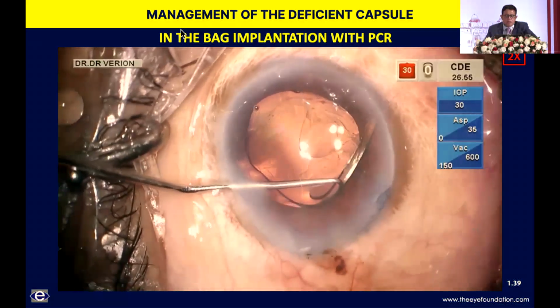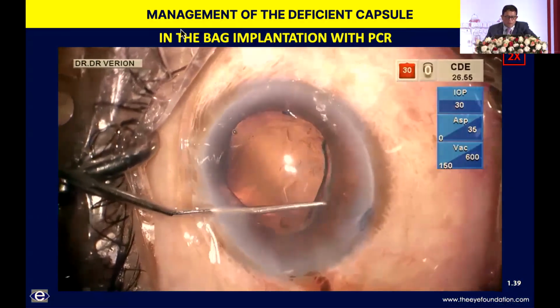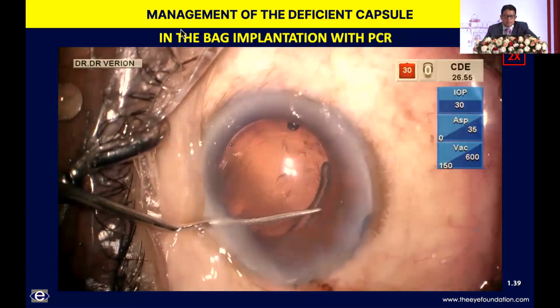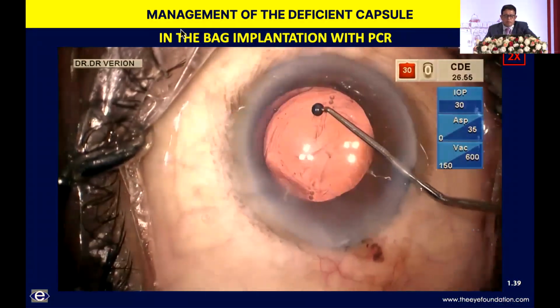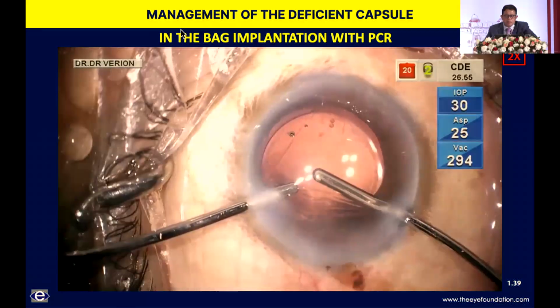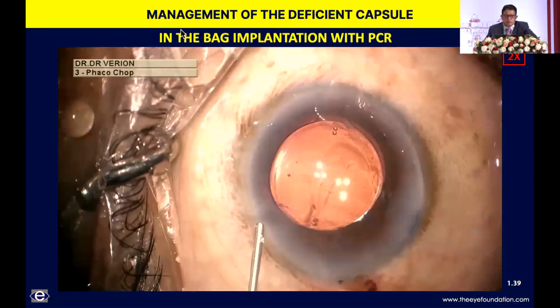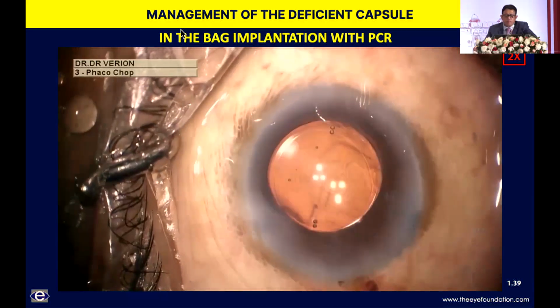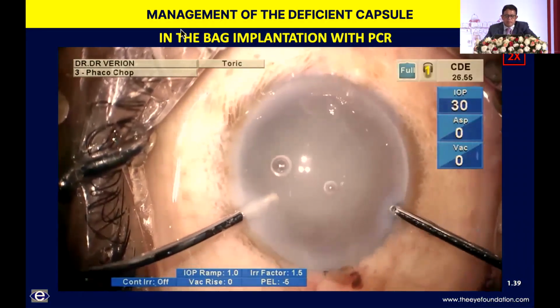I have not done any anterior vitrectomy in this case because the anterior vitreous space is tamponaded. Though the orientation of the haptics has to be around the area of the rent, because there's capsular support available, as you can see with the digital overlay that will come on towards the end, I'm able to position the lens in the direction where it's meant to be.